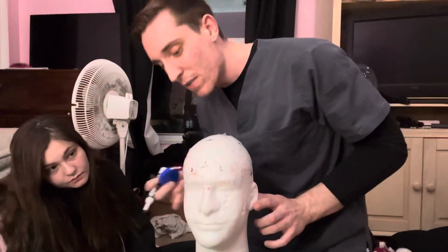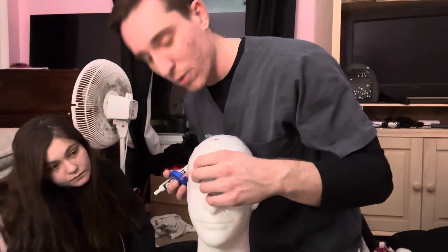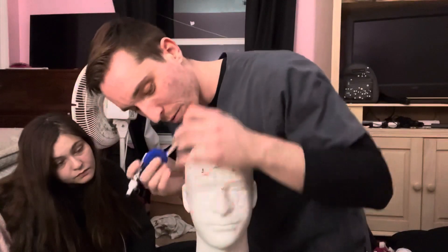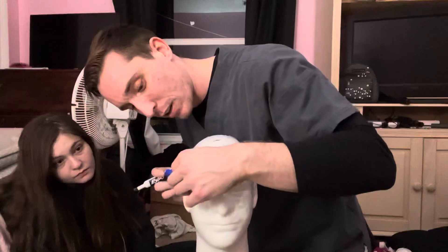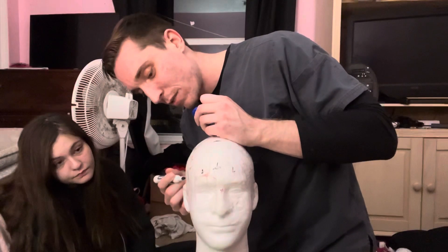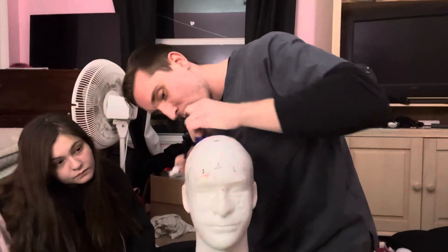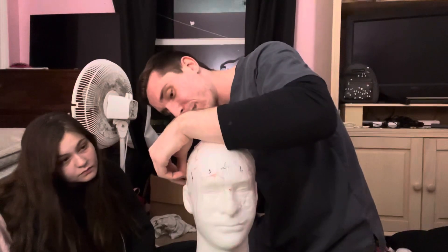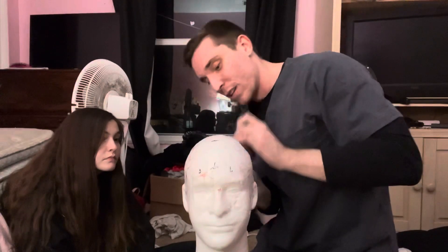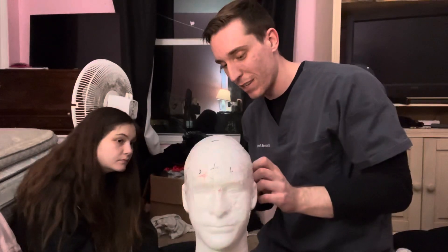Going around the head, it's just going to be a bunch of 10% measurements. 10% of 55 is 5.5. So you make the first one at 5.5, then make another one at 5.5 — that's going to cross your T4 mark. Go another 5.5 right here, and another 5.5, which is going to be your T6 mark. Then another 5.5, which will get you your O2 mark. And if you do 2.75, then you'll be at your OZ back here.